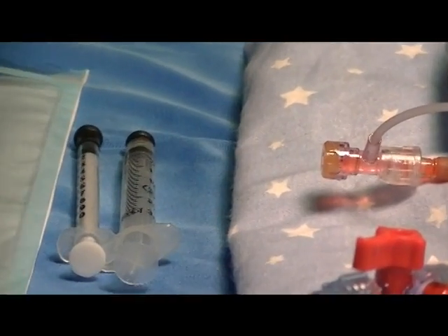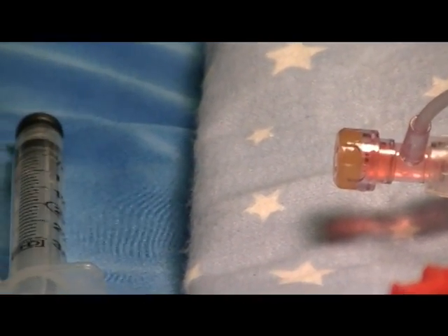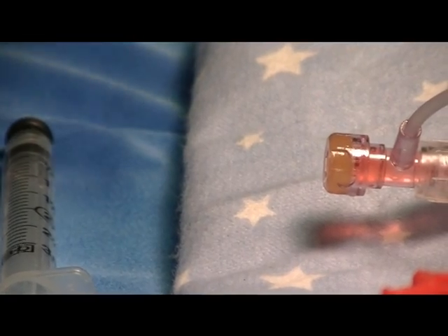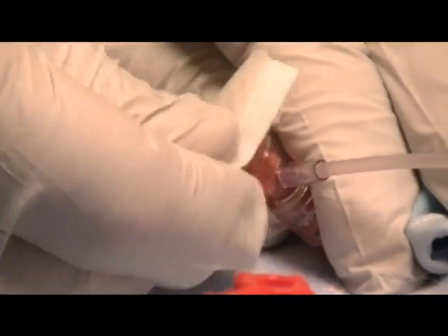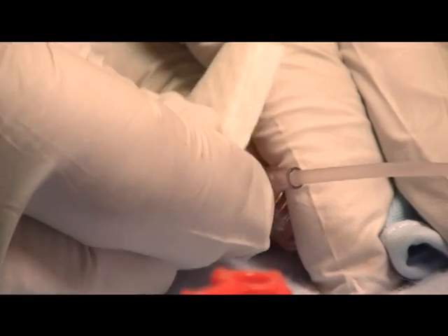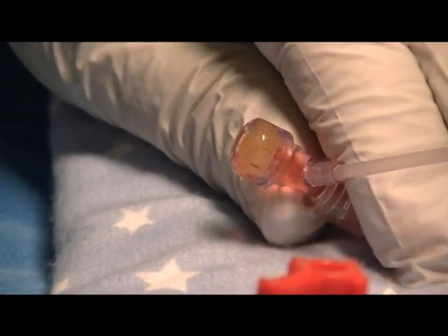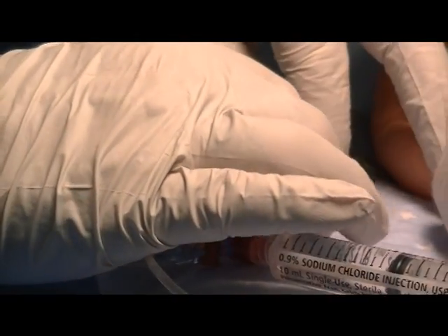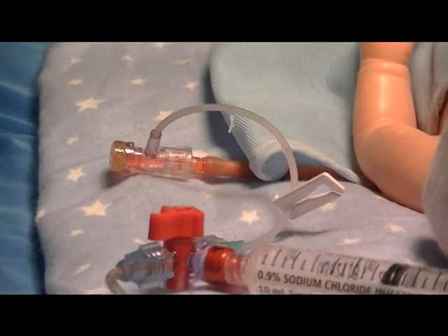First, remove the prep material and appropriately prep the split septum T connector according to your hospital's policy and procedure. Then clamp the clamp on the T connector line to prevent flow from the arterial line.